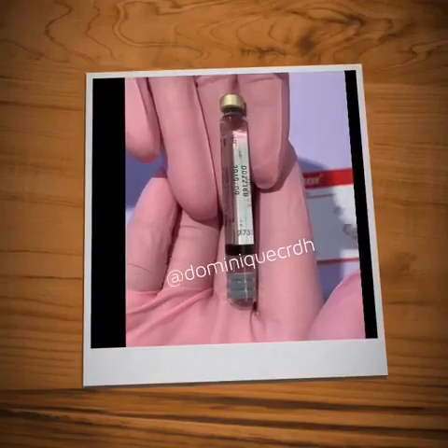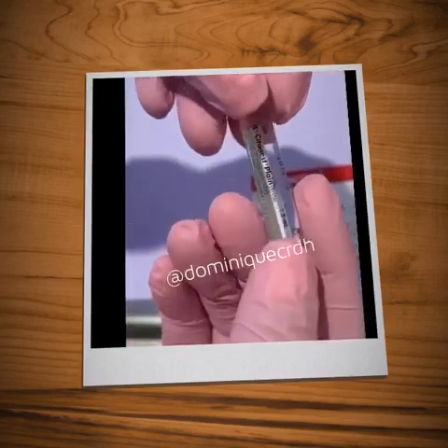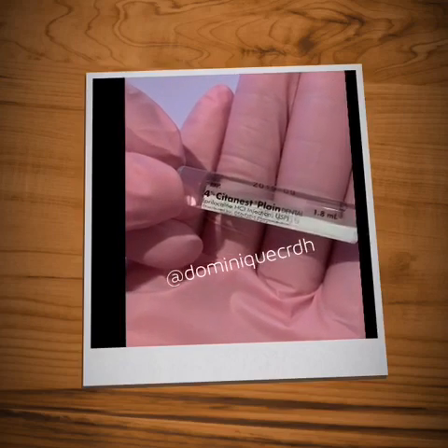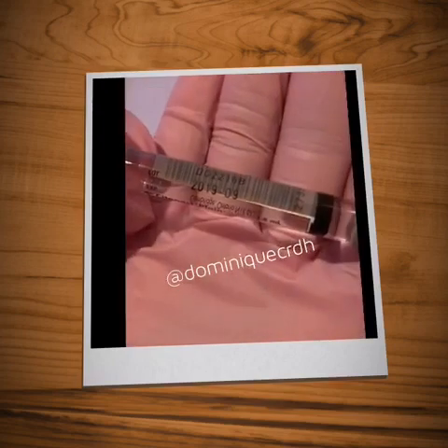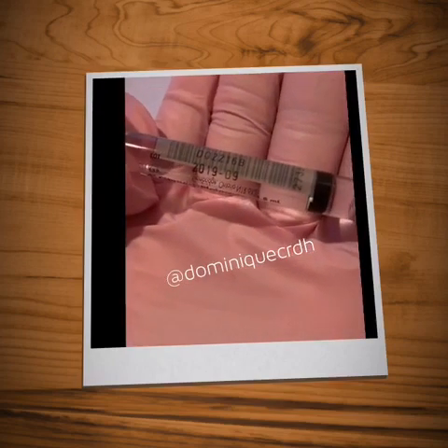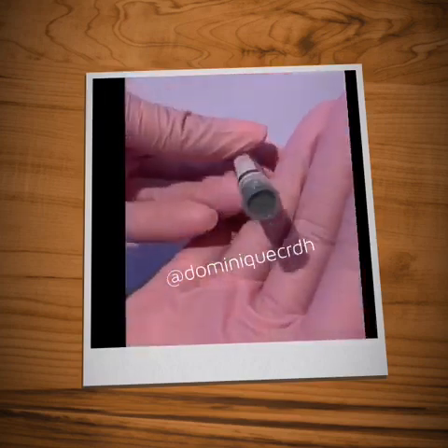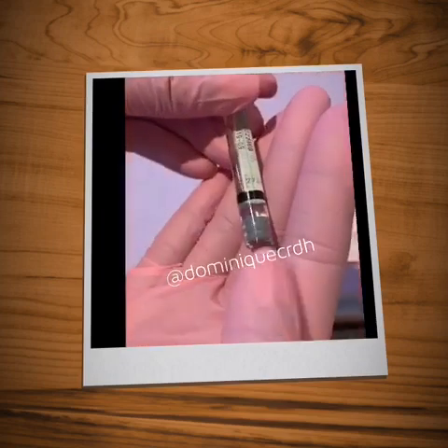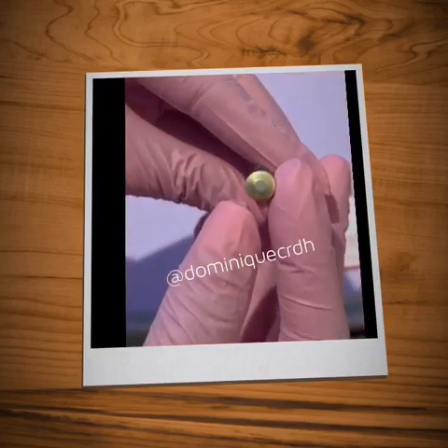Inspecting the carpule is a very important step when administering anesthesia. I always want to make sure that I have the correct drug of choice. Also, I want to check to make sure that the anesthetic is not expired, and there's an expiration date on each carpule. I then check the rubber stopper to make sure that it is intact and not tampered with. And then one of the last things that I do is check the diaphragm to make sure that it is sterile. You can use an ADA-approved disinfectant to clean off the diaphragm, but never alcohol.